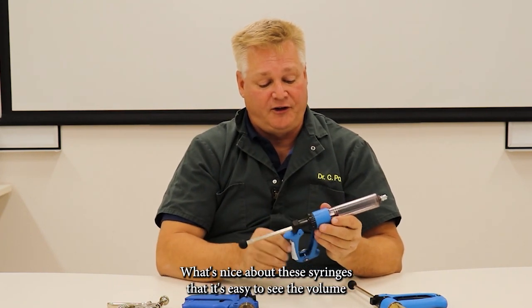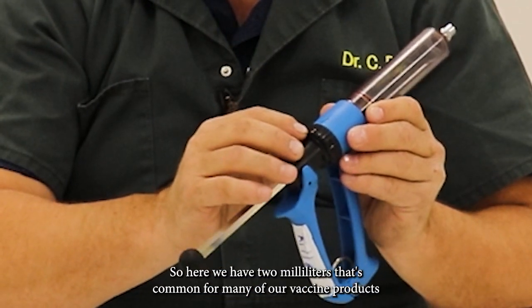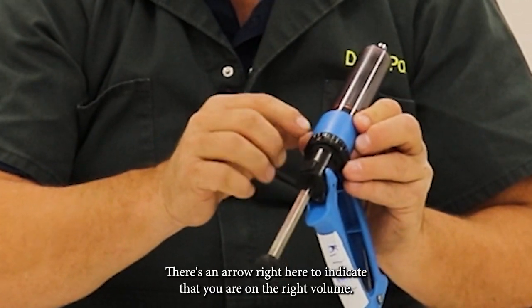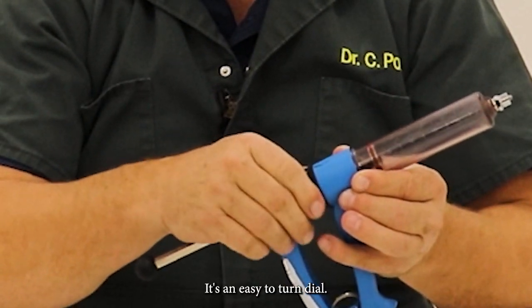What's nice about these syringes is that it's easy to see the volume that you will be administering. Here we have two milliliters, which is common for many of our vaccine products being administered subcutaneously nowadays. There's an arrow right here to indicate that you are on the right volume, and it's an easy-to-turn dial.